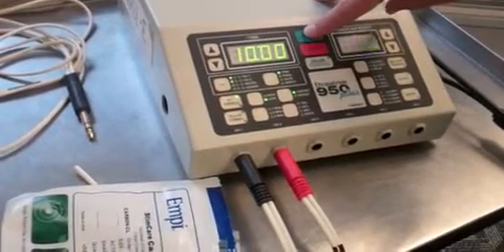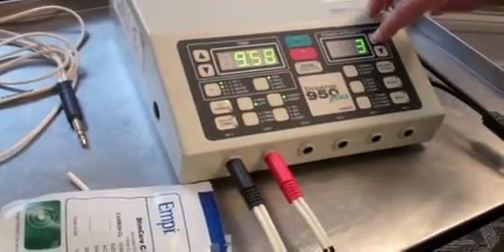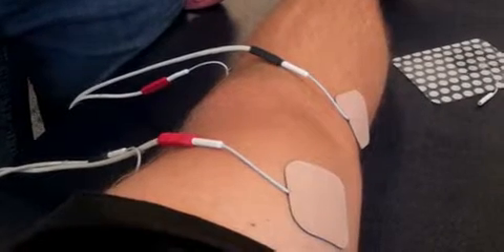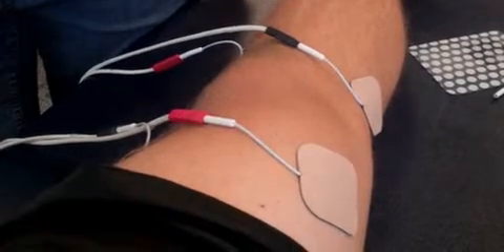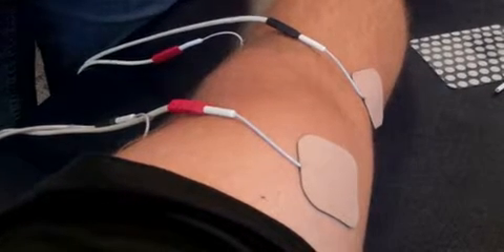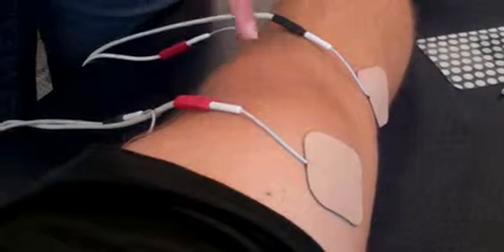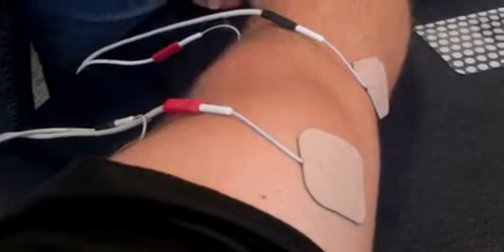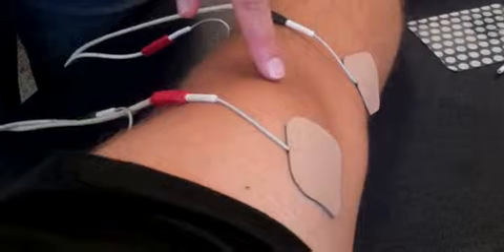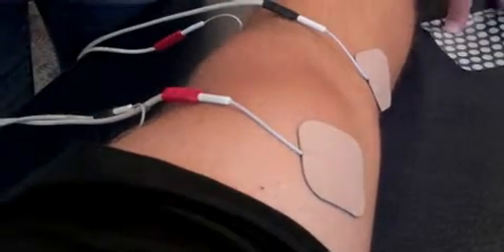I'll increase the intensity until we see a muscle twitch. We might not get one just because of our electrode placement, but we'll watch and see. We're getting a little bit of a muscle twitch, and then we'll back it down a little bit. As long as we have a muscle twitch, we know we're at motor level. You can see a little bit of twitch taking place here. That'll run its course, and then it'll automatically shut off. We take the electrodes off and put everything away.